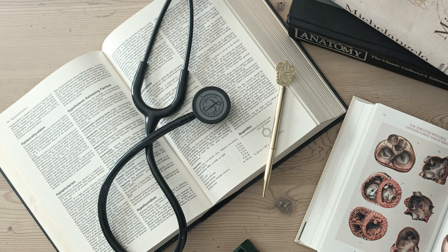And what if the escape rhythm is coming from really deep in the ventricles? Right. If the escape rhythm originates from deep within the ventricles, beyond the bundle of His, it's called an idioventricular rhythm. In these cases, the QRS complexes will be extremely slow, like 20-40 BPM, very broad, and often have an abnormal axis, and the T waves might appear abnormal or inverted. This appearance indicates very slow, inefficient conduction through non-Purkinje ventricular tissue. It's literally the heart's last resort and hemodynamically very unstable.